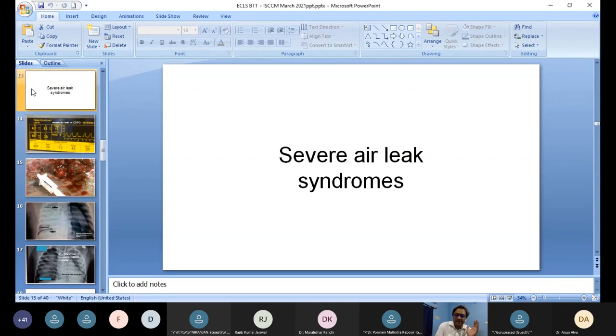What is the usefulness of this? So as you can see in this particular patient, they can be awake. The most important thing is physiotherapy, their ability to give consent. So when we talk about COVID and lung transplant, it is very important. Some of the guidelines, I'll discuss that with you at the very end, that they are able to consent to a lung transplantation. So again, this is one of the devices that is very helpful in these patients.